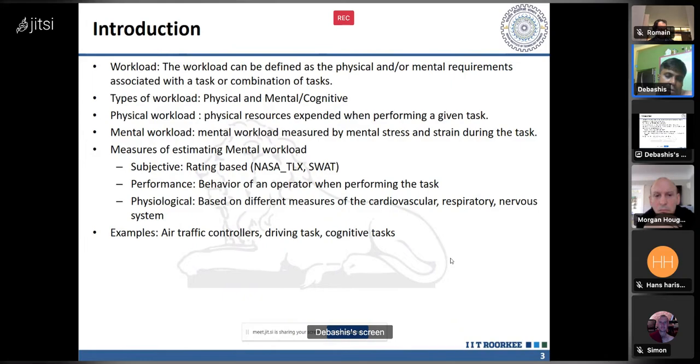Suppose in some experiments people do a post-experimental task. For the N-back task and mental arithmetic, in which task they felt bored and in which task they were more attentive. These are the parameters, and parametric tests have been done by statistical tests based on the performance, the performance of the subject during the task. This can be measured with the subjective ratings.